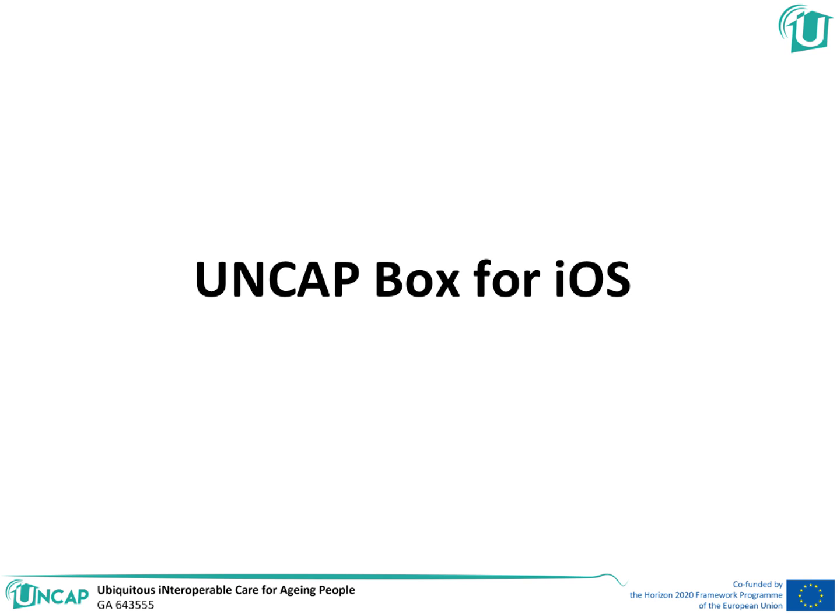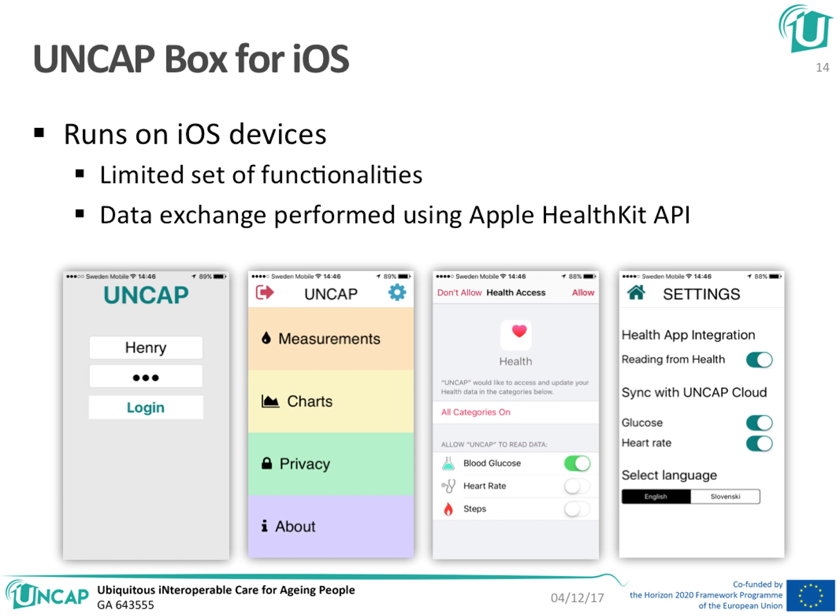Now there's also an UNCAP Box version for iOS. But since iOS has many more limitations on how to perform cross-application communication, we've only supported a limited set of functionalities. For data exchange, we've used the Apple HealthKit API, and here you can see that once the UNCAP application is authorized to read data from HealthKit, it can in fact fetch data from most HealthKit compatible apps.